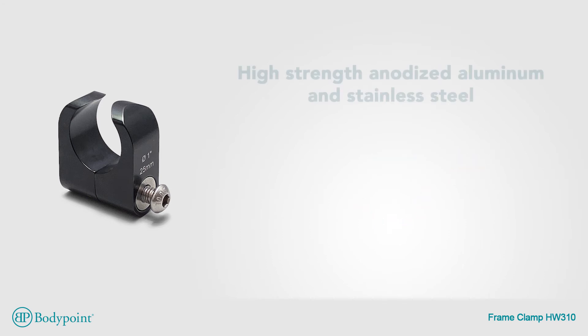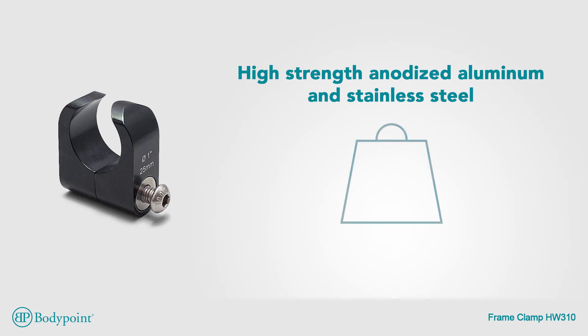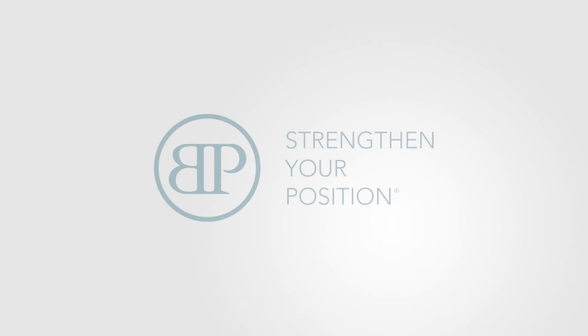Made of high-strength anodized aluminum and stainless steel, it ensures a long life in the most demanding environments and can support 350 kilograms.